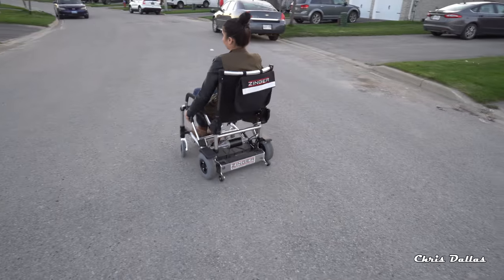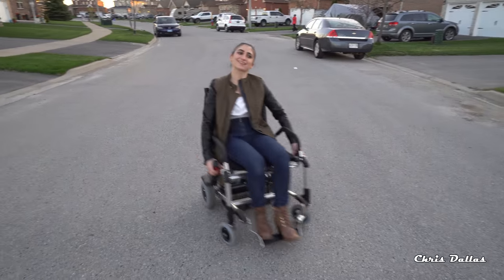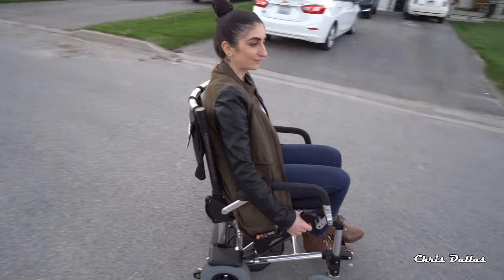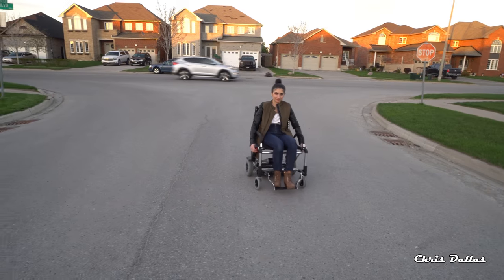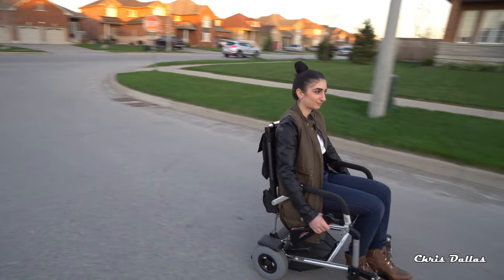What do you think of this chair, Areti? I could use this all day. This is the first time she's been in it — she's never tried it before. It was about a minute learning curve, that's all it was. She learned it, and now she's like a pro.